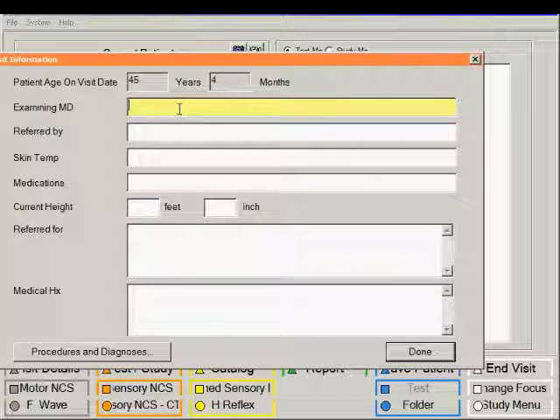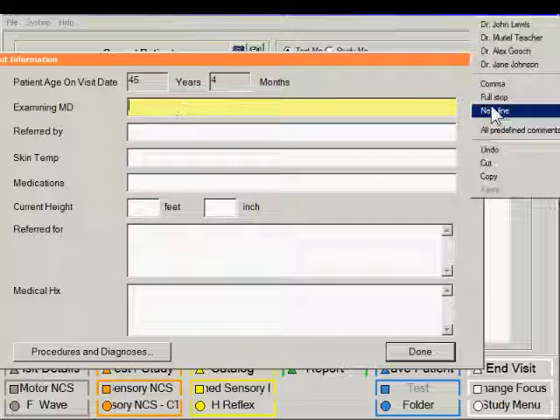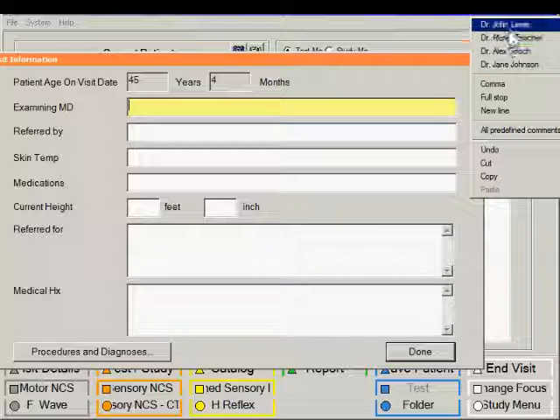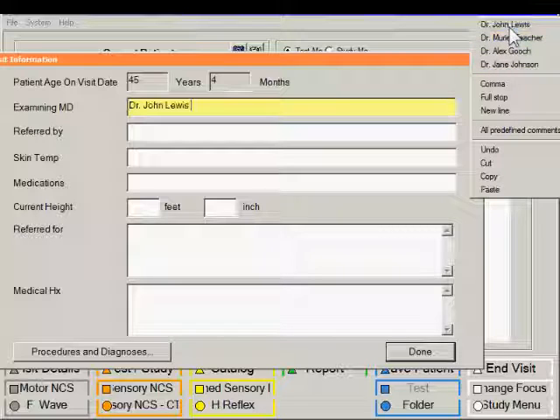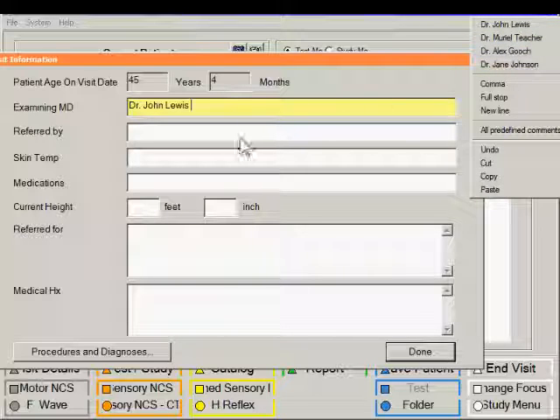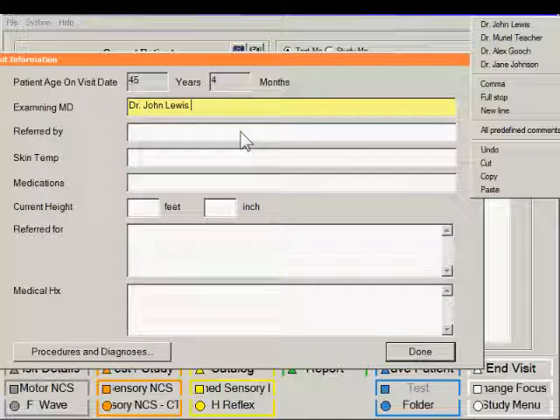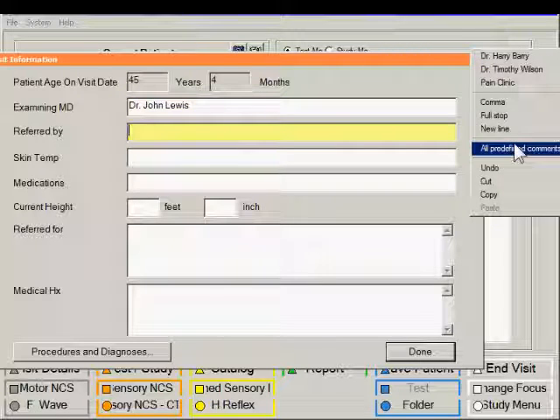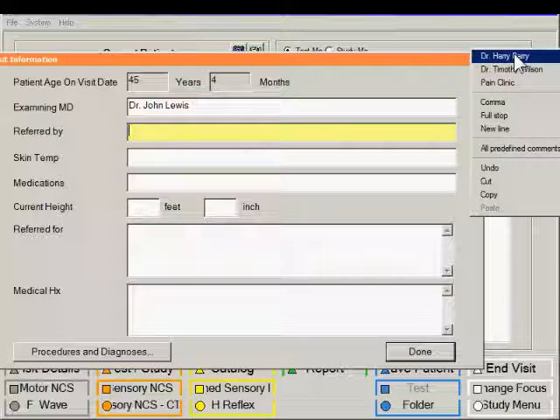Under examining physician, you can just right-click this field and a small pop-up window appears where you can select the physician name. Same thing is also true for the referring physician. Again, right-click and you have another choice of names.